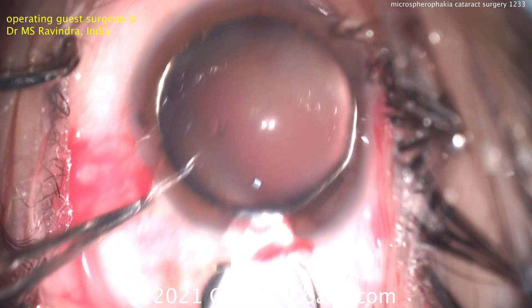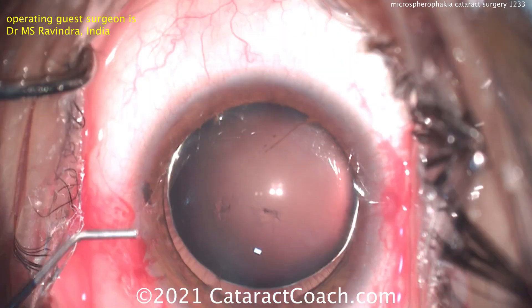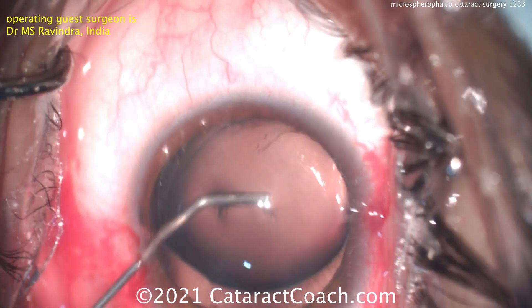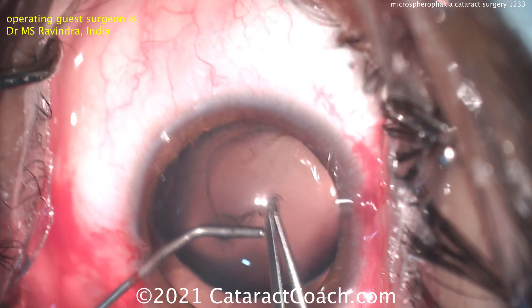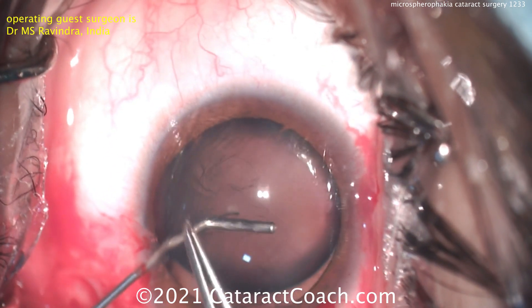With that extra hole that was incised, we can use a blunt cannula to help fixate that nucleus. There's the left hand blunt cannula to help fixate the nucleus, with more viscoelastic going inside the eye. Now remember, this lens has a very small diameter, but the anterior to posterior dimension of this lens is very large.